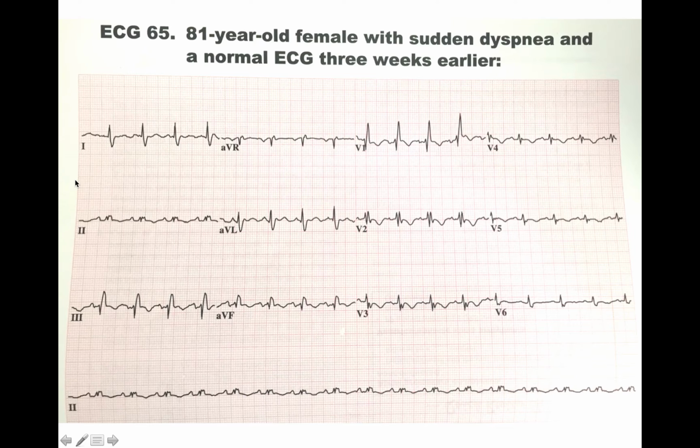So overall, looking for the sinus tachycardia, somebody acutely short of breath, if you had a pulse ox on them, a diminished pulse ox, all should point you into pulmonary emboli.